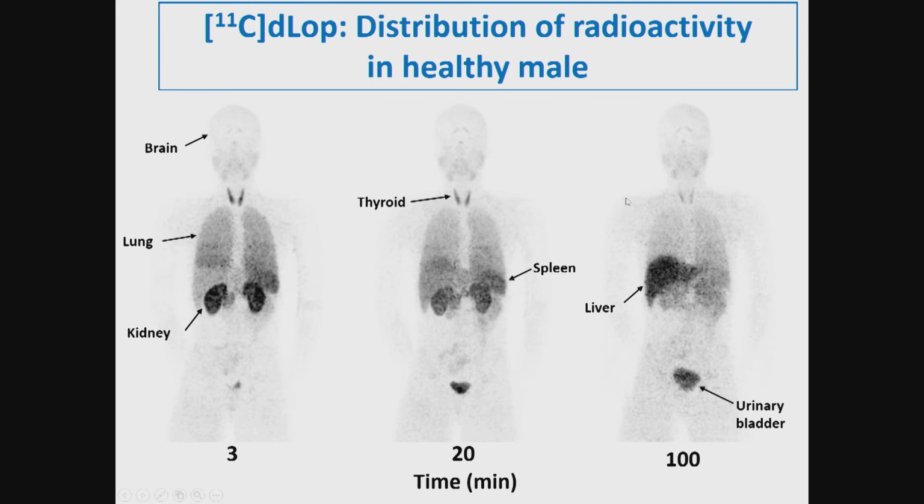I know when I showed this some years ago to some females in the lab, they said, oh yeah, this is a typical male. No brains, no uptake in the brains, and no uptake in the testes. Typical male, no brains, no balls. And that's true, because the PGP blocks the entry into the brain and into the testes. Okay.